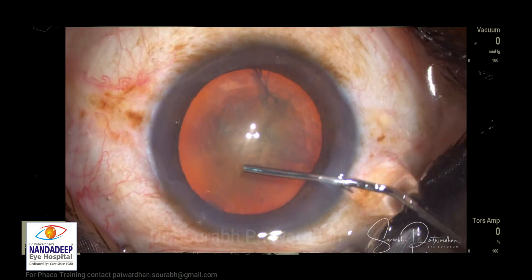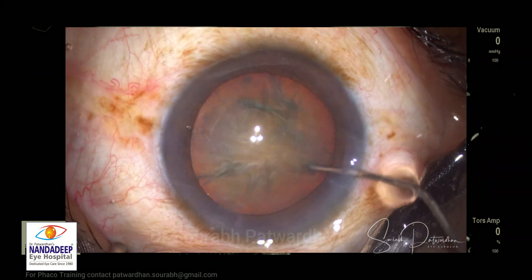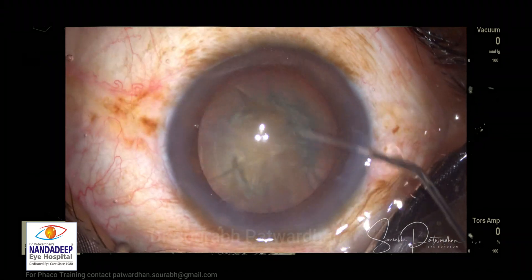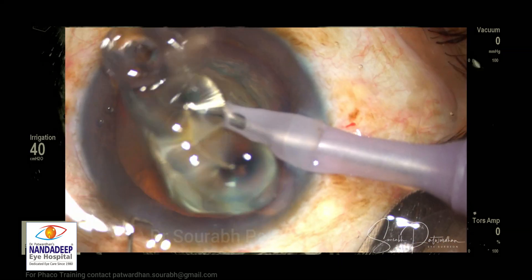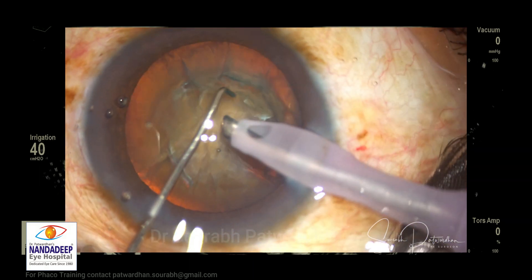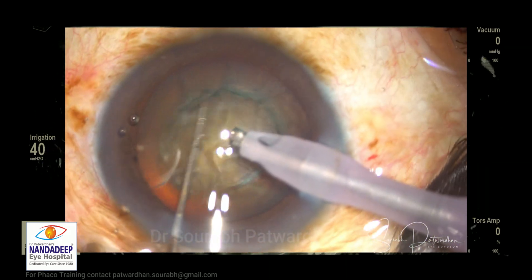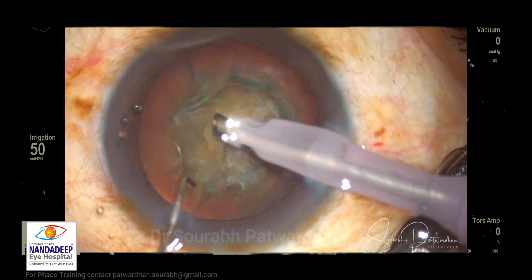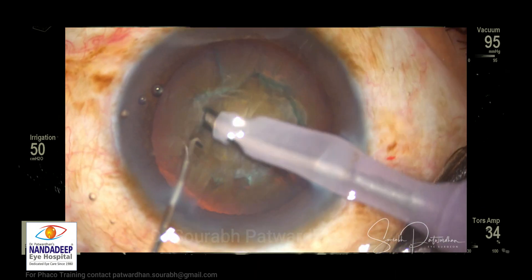Denser cataracts are easier to hydrodissect and also rotate. During the first trench, I will be using lower IOP. I start off with 40 centimeters of water, as you can see on the left side of the screen, and then I raise it to 50 centimeters.